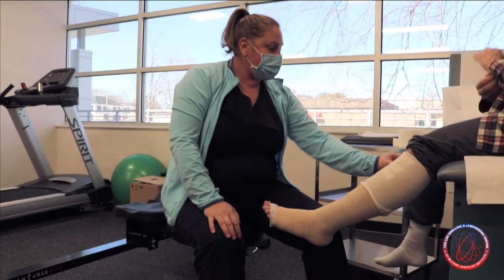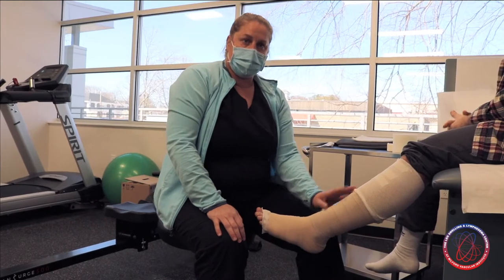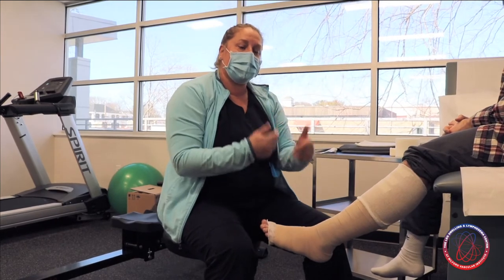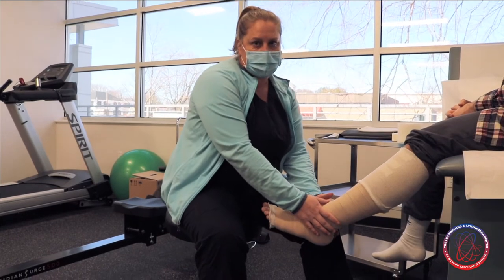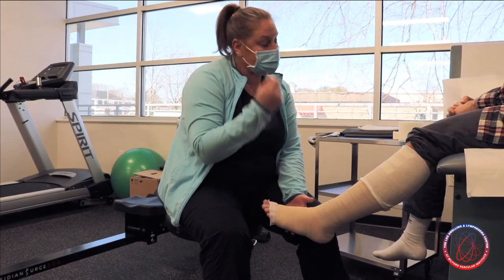The compression bandages are going to remain on for anywhere from 22 to 24 hours. You'll take them off to shower and again perform your skin care. When you take them off, you're going to want to re-roll them so that it's easy to apply again — it also helps the bandages maintain their shape. So take it off, shower, let the skin dry and breathe, and then reapply.